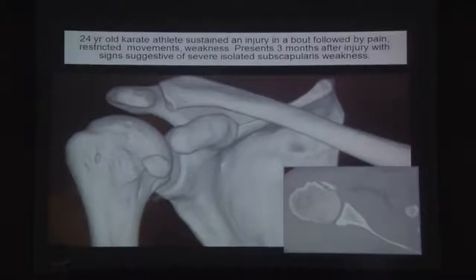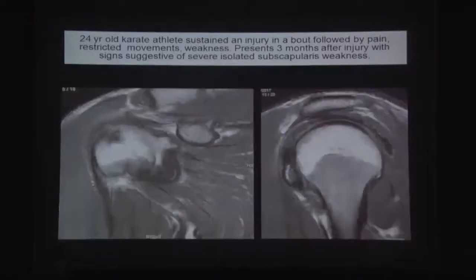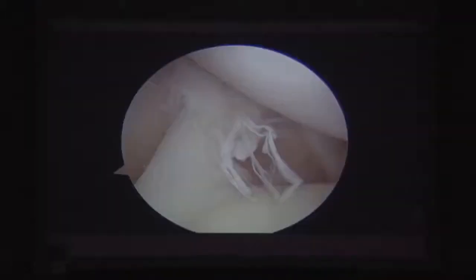A case example: a 24-year-old karate athlete with a lesser tuberosity avulsion fracture that is three months old with severe subscapularis weakness. On MRI the fragment is attached to the subscapularis, and coronal views show the retracted subscapularis. The supraspinatus is intact.